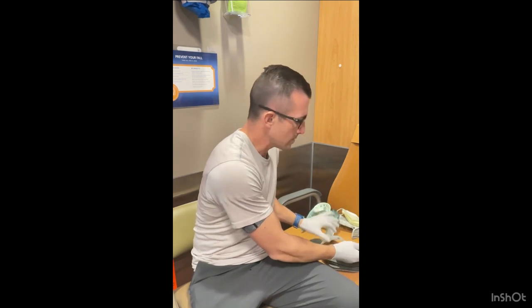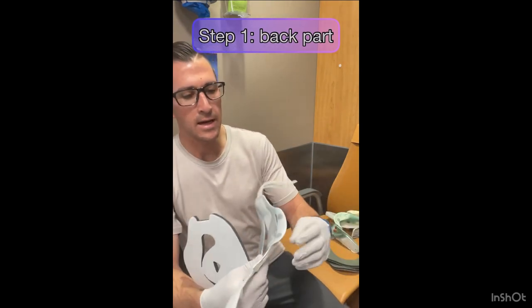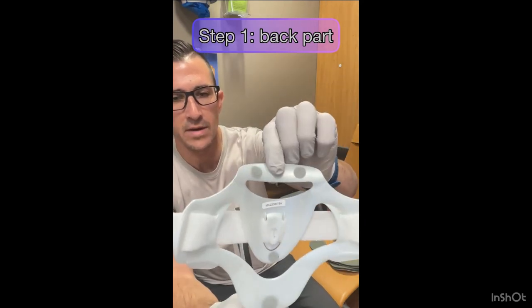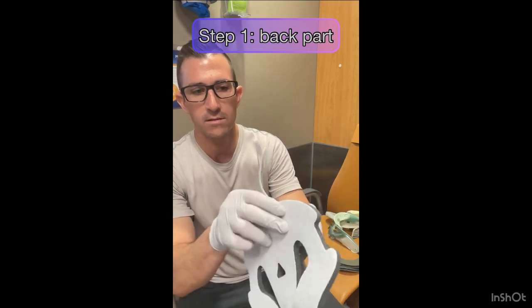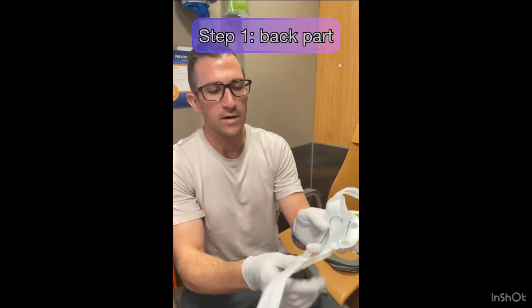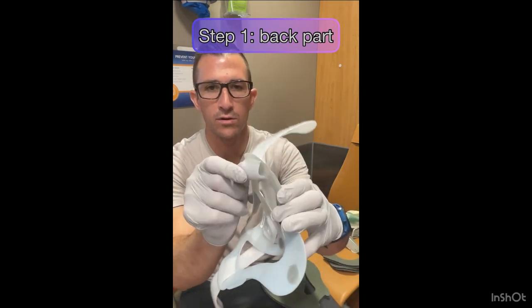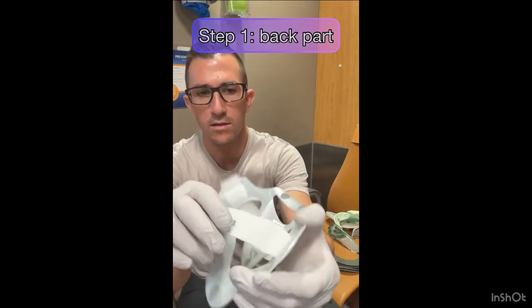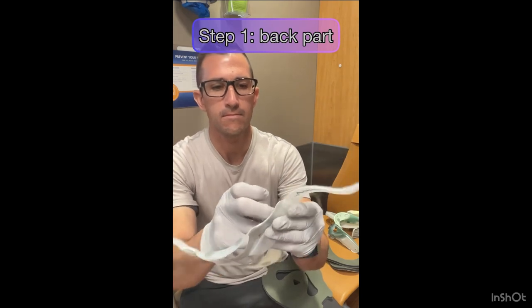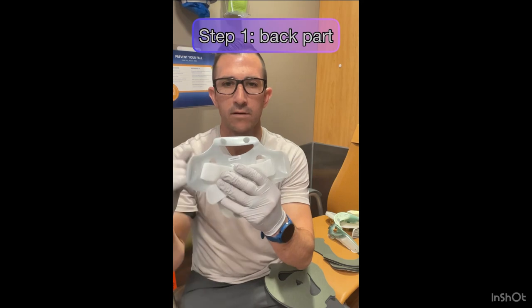When you look at this, the more pointed part goes towards the bottom. Starting with the back part of the brace - on each brace there's velcro. The back one has four velcro spots and the velcro will only stick to one side of the padding. The firm part has a strap, and what we're going to do is pull out the strap on one slip, not both, and we're going to do that to both sides.